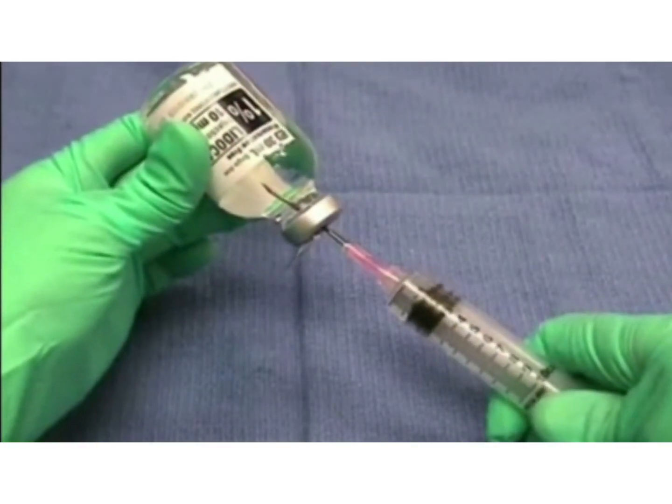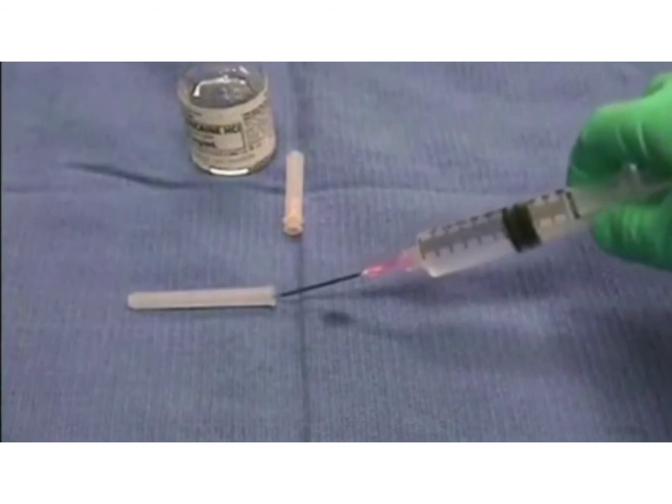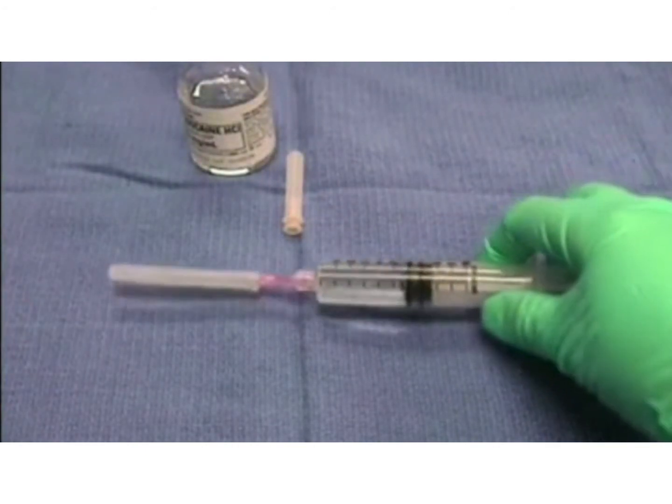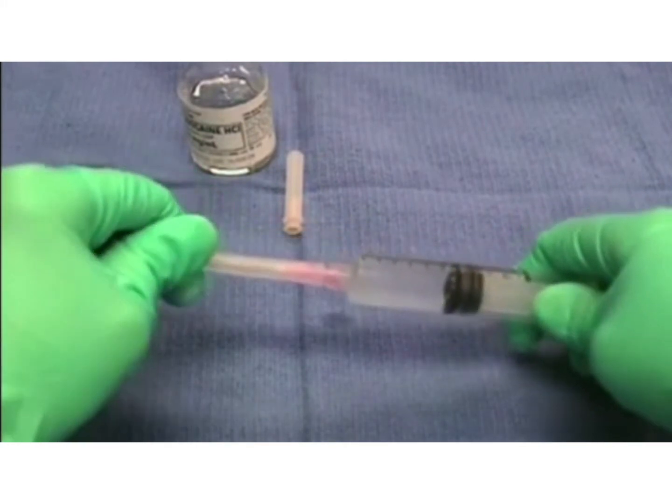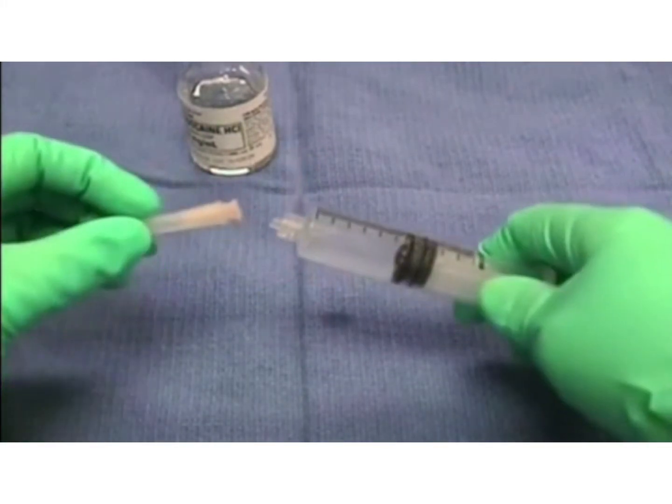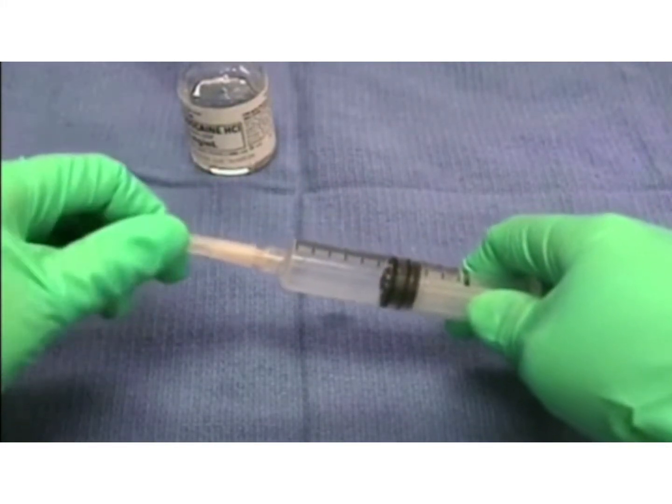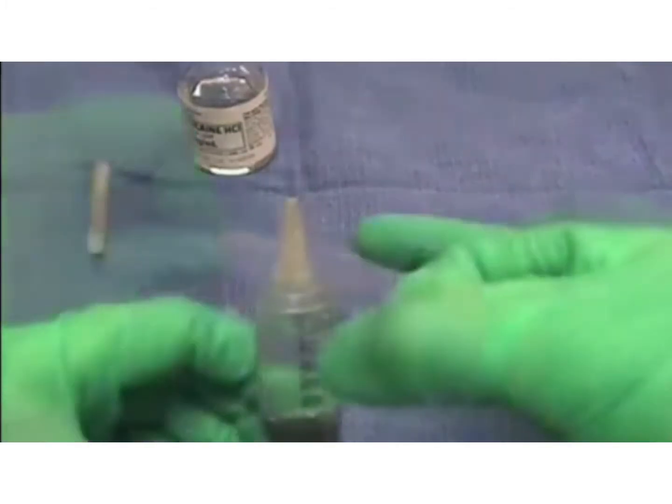Carefully recap your needle using the single-handed scoop method to prevent needle stick injury. Exchange for a smaller 25 or 30 gauge needle, and push out any air bubbles by directing the needle upwards towards the ceiling.